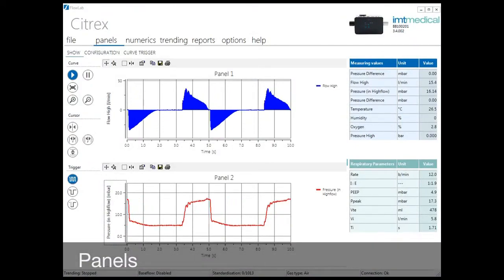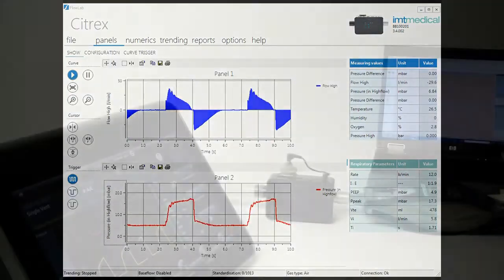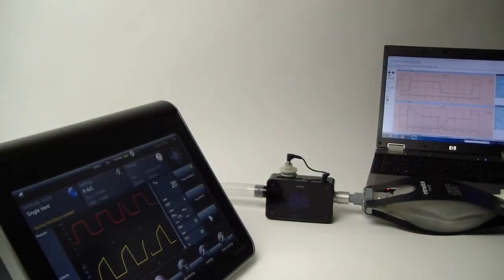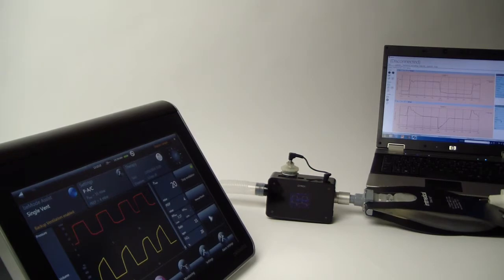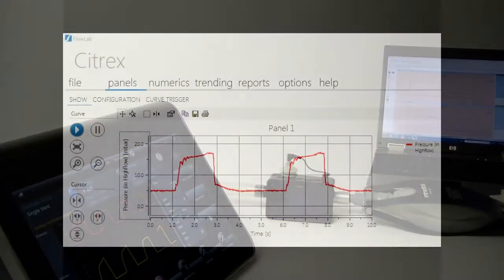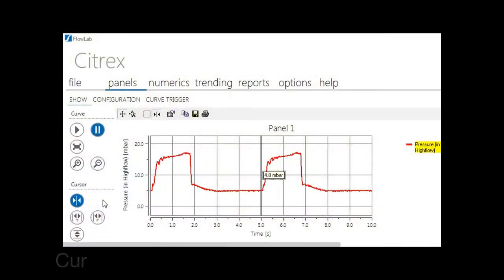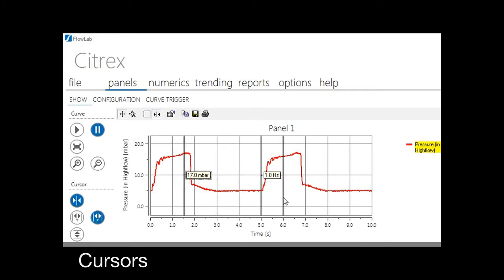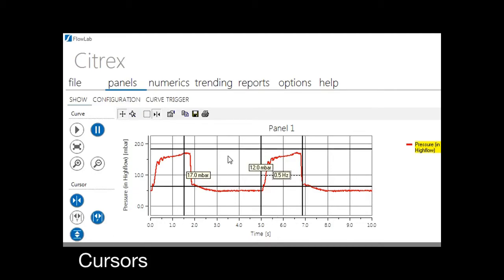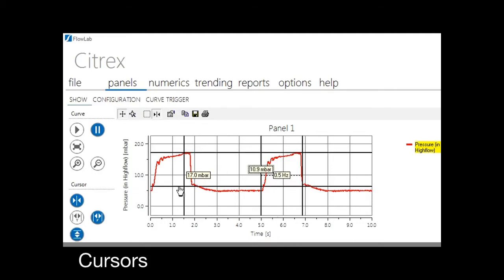Display your data in up to three real-time panels and analyze each graph with various cursors. With a sampling time of three milliseconds, artifacts and glitches can be detected in an easy way.